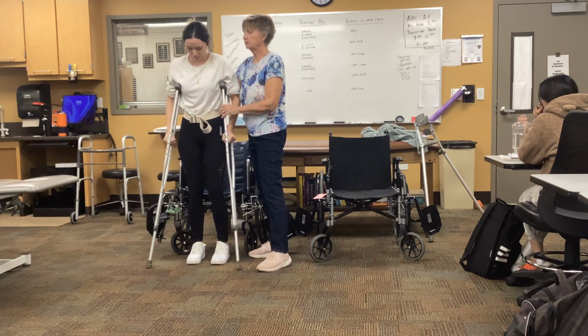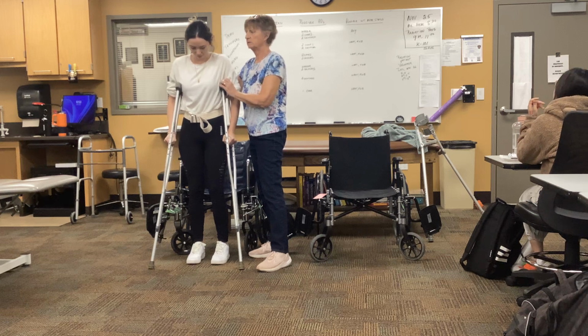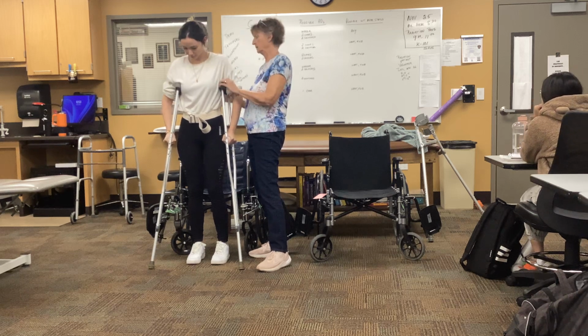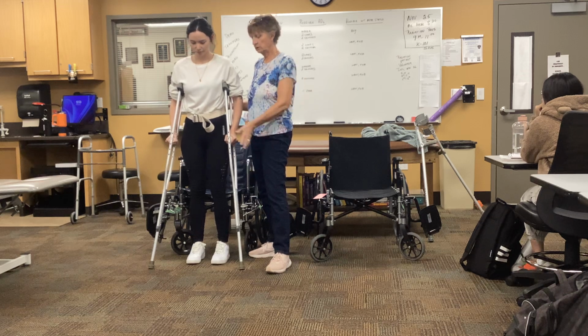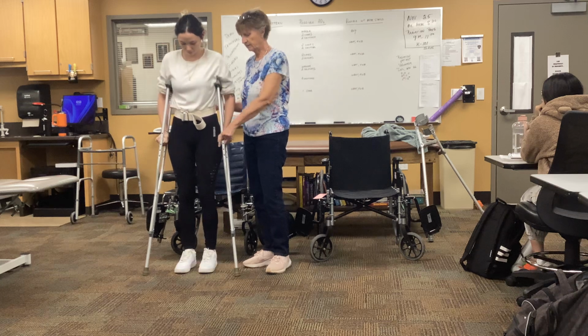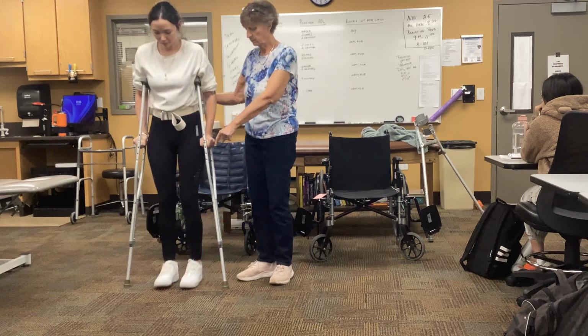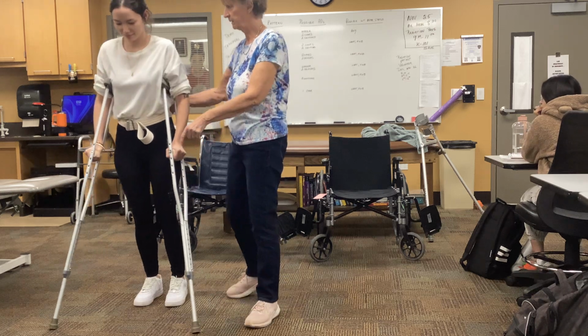Sure, so she's got kind of a floppy top on here. Make sure that it's not caught on her shirt. Okay, so let's start with swing 2. Both crutches together, both feet together, right to the middle. There we go. Feels a little bit jerky.